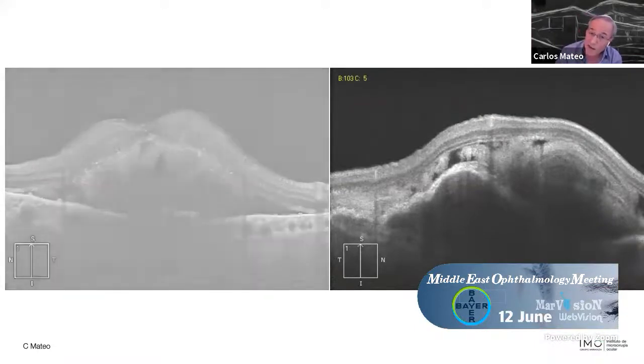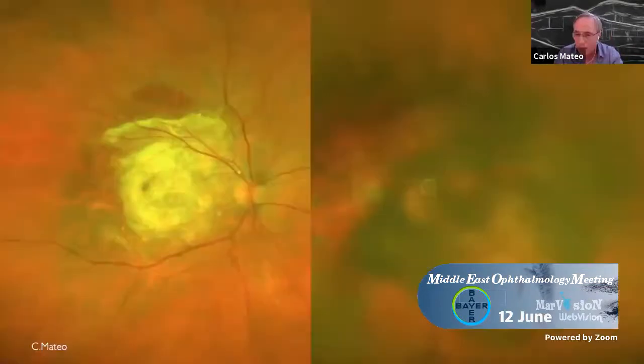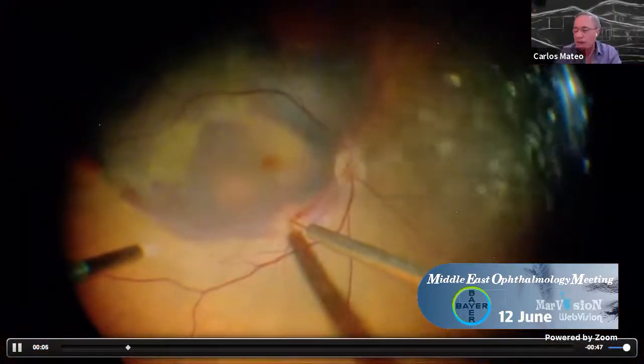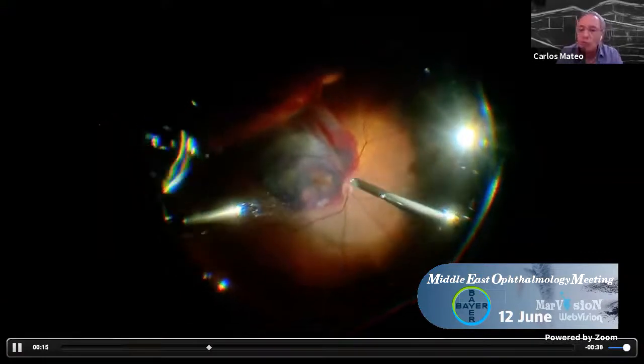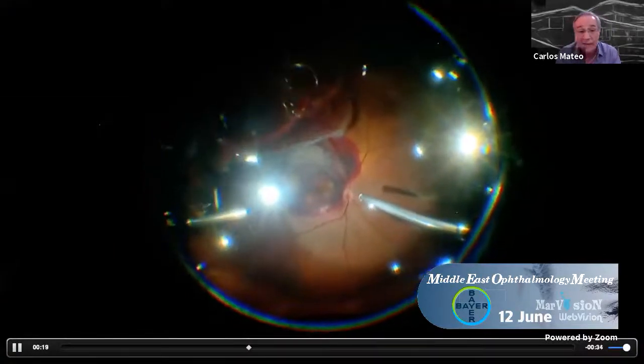The other side is when the hemorrhage is under the RPE. This is totally different. Look at this case, the right eye previously affected, the left eye with a massive vitreous and subretinal hemorrhage. Then I did the same. I used the technique of Tamer Mahmoud from the US. He was injecting rTPA and air, trying to move the blood more to the inferior parts of the retina. And then I did it.